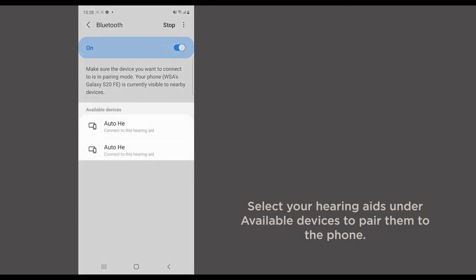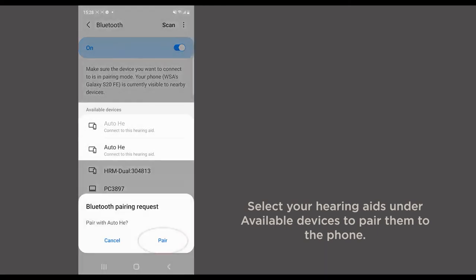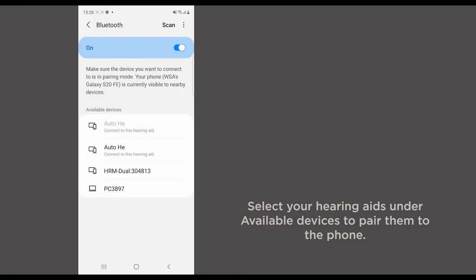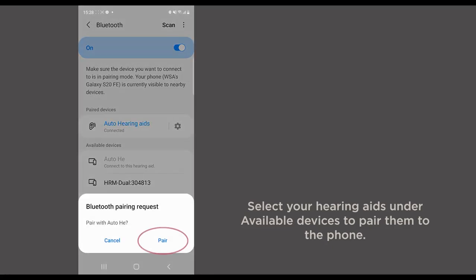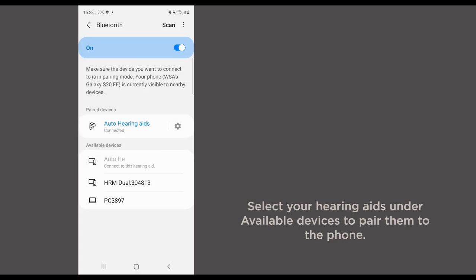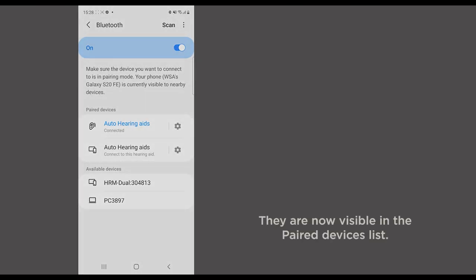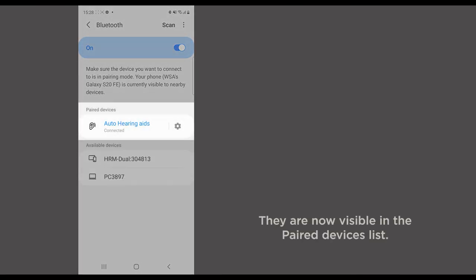Select your hearing aids under Available devices to pair them to the phone. They are now visible in the paired devices list.